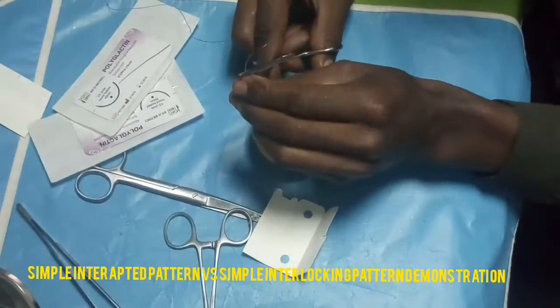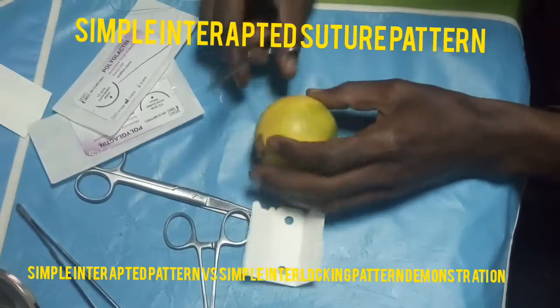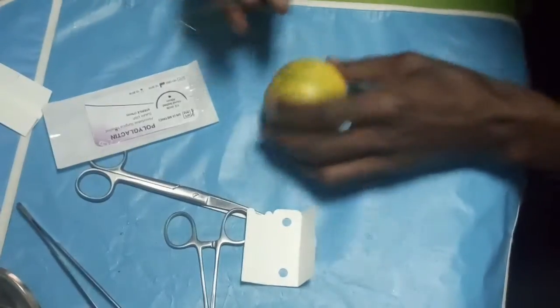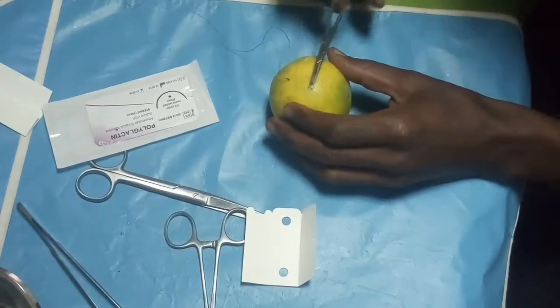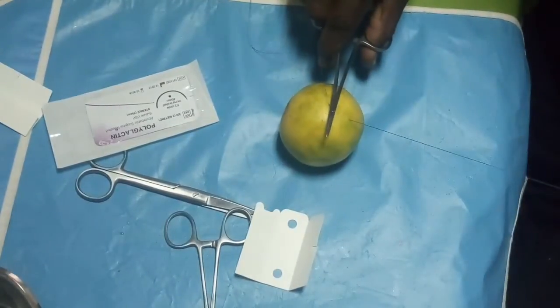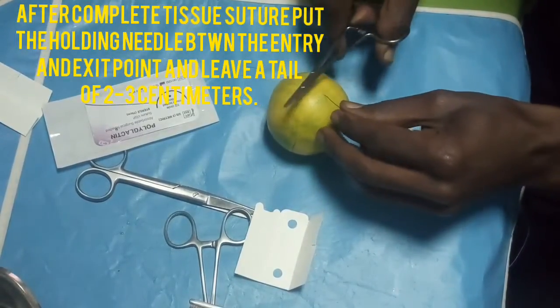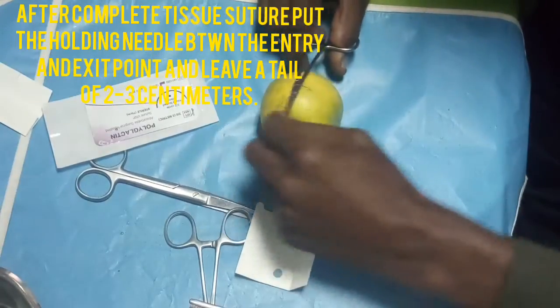First of all, we have to know that in any suturing area, we have to make some type of two knots. The first knot depends on the type of suture that you are using. If this is the non-absorbable suture, you are going to make 4 to 5 throws. So the simple interrupted suture, you hold the needle like this, put it in between with the needle holder between the entry point and exit point. You hold it like this and you count 1, 2, 3.